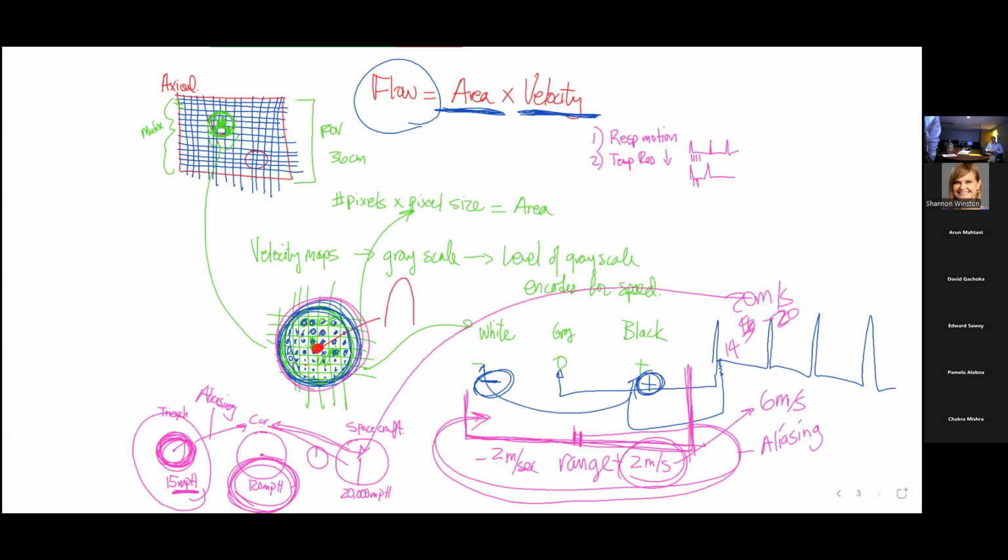Because we need one that is sensitive to motion and one not sensitive to motion. Number three, we've got to think about the dynamic range of what we're doing so we don't have aliasing, and then also so we make the correct measurement.